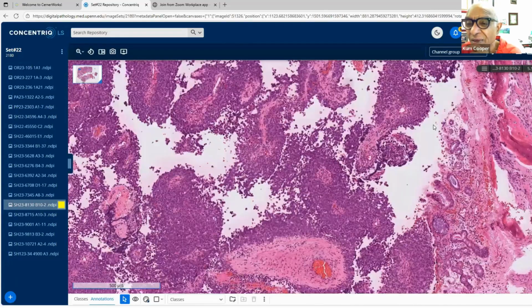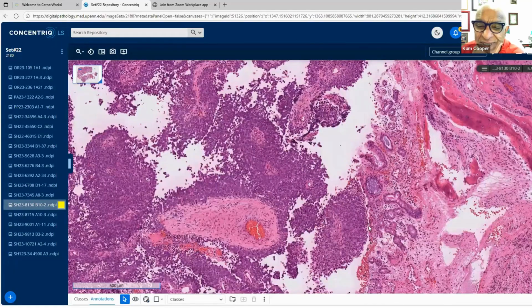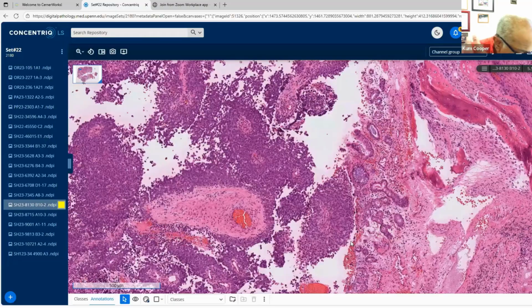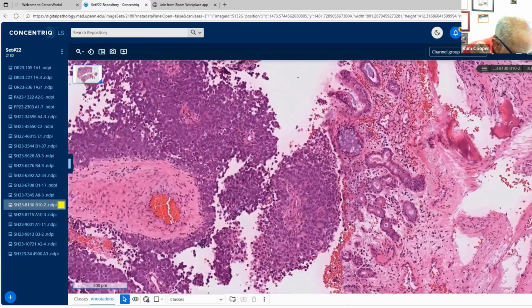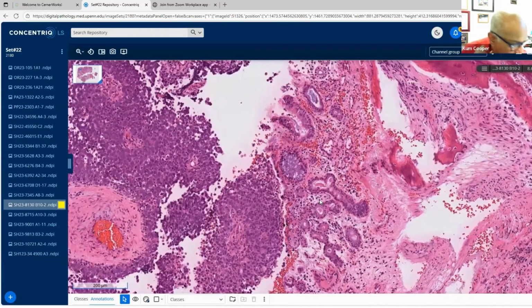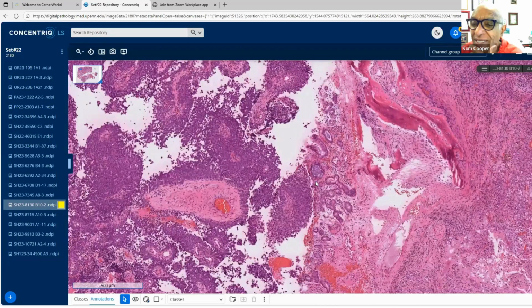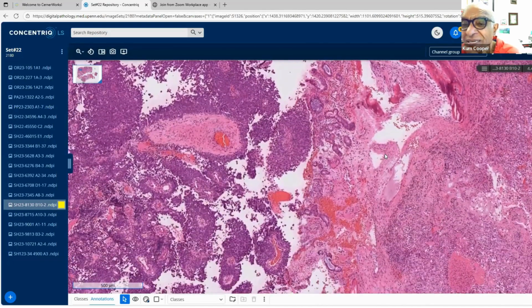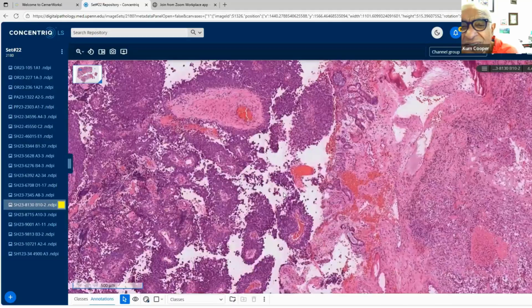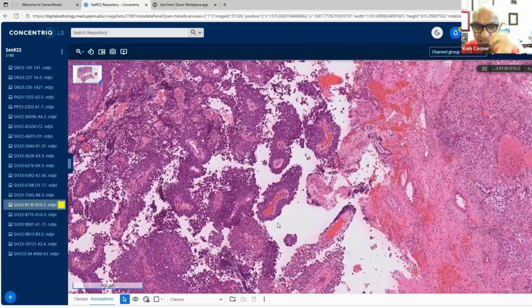And that's sitting directly on bone, okay? So it is sinonasal, if you will, but it's skull-based in that it's in that location. So surgeons like to use skull-based tumor, base of the skull, but it's truly sinonasal. Here, looking away, hemorrhage, necrosis. Nope, not worth showing you that. But here you can see these.